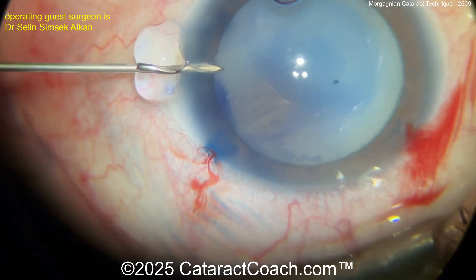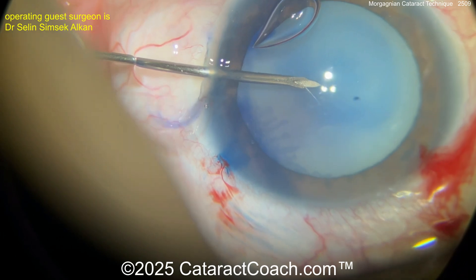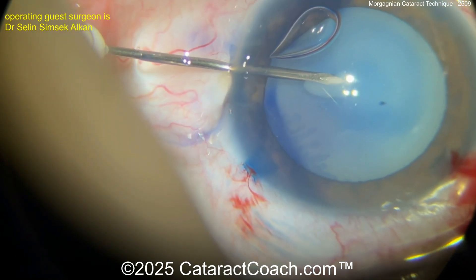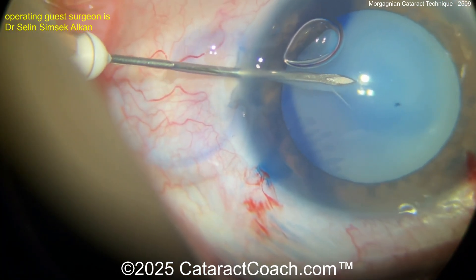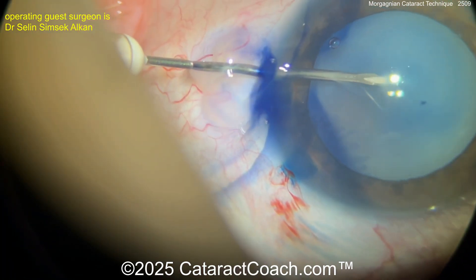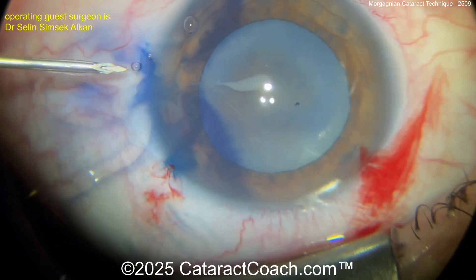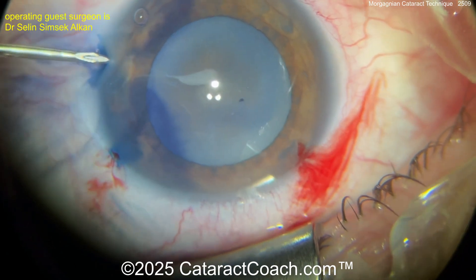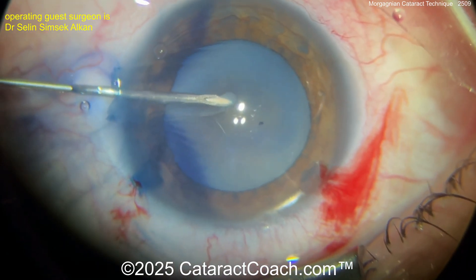Back in the case, you're going to start off with a needle decompression — going in with a hollow bore needle, poking the lens capsule. Look at the milk coming out. Aspirate. What's the risk of Argentinian flag sign here? It's actually pretty low because this is an intumescent cataract — fluid-filled and intumescent — but it's not highly pressurized. The capsular bag is not very pressurized at all.